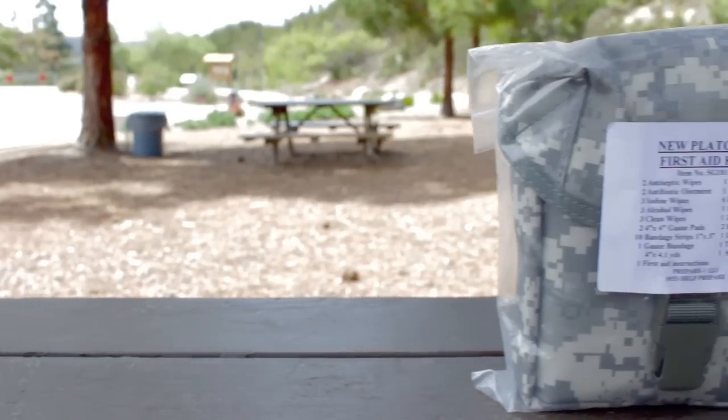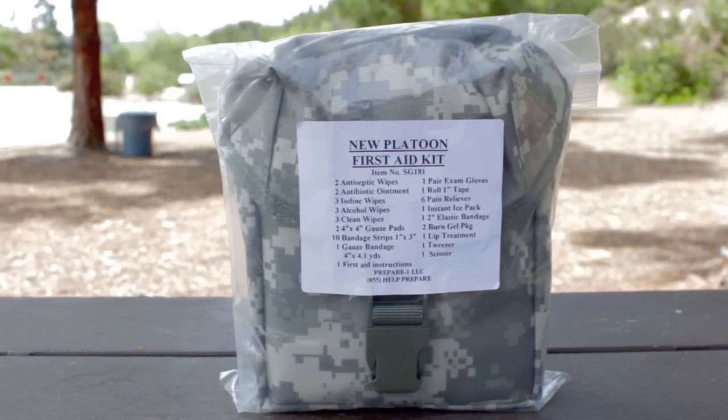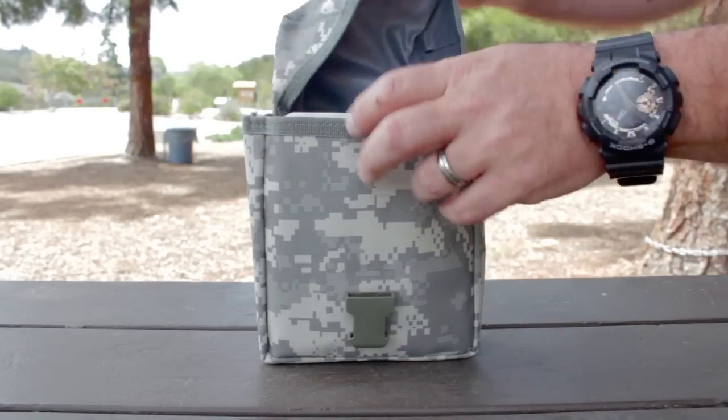Hi folks, this is John with the Wingman 115 channel. Today I'm going to be doing a quick overview of the new Platoon First Aid Kit from prepareone.com. I'm going to lay it down on the table here, open it up, show you the contents, and give you my thoughts on it.